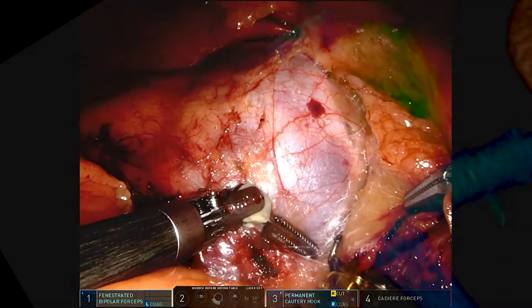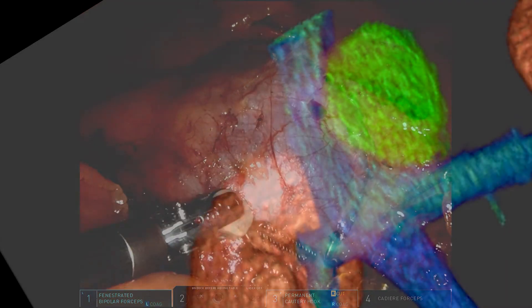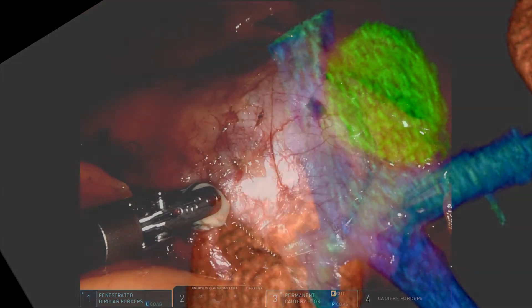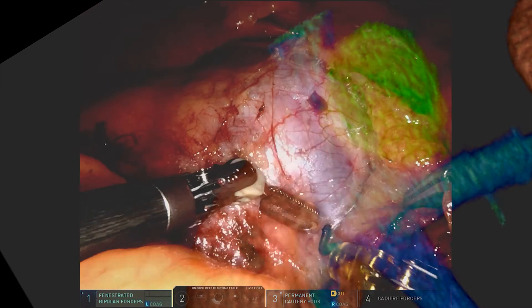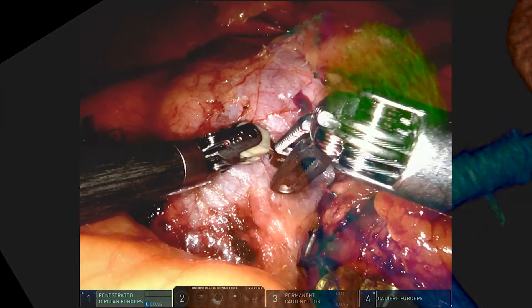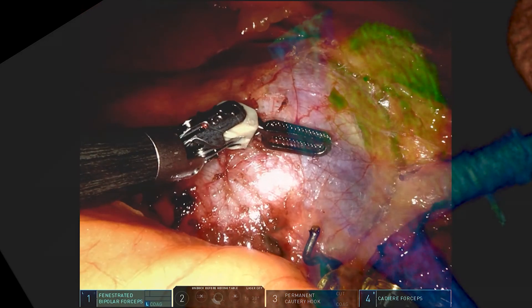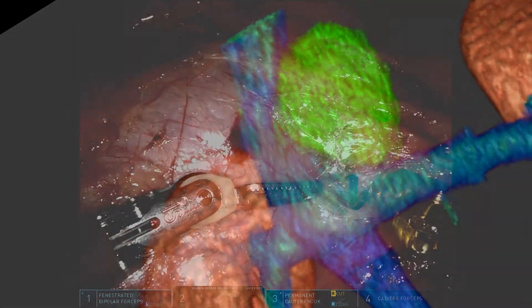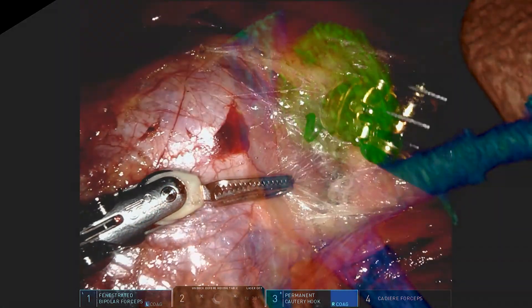As shown here, projecting the 3D imaging to reality provides your surgeon additional guidance and reassurance during the dissection in the risky areas.